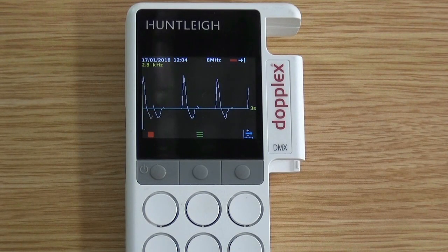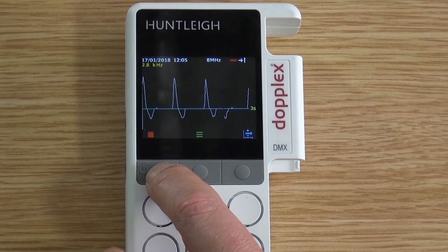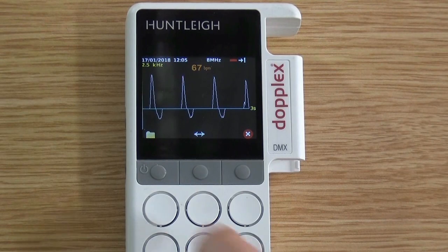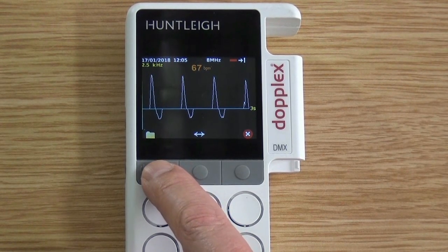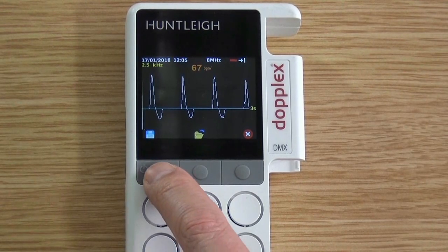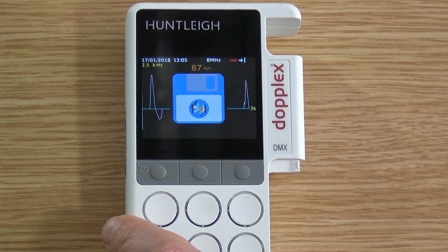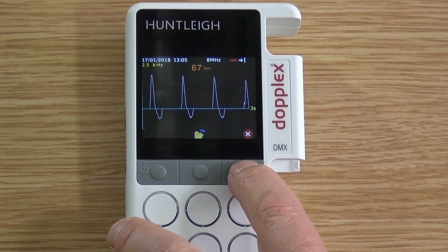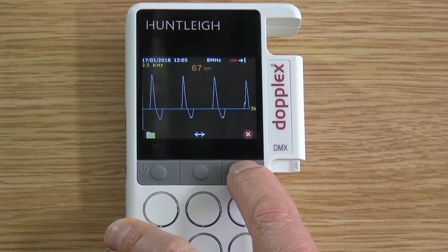Once a waveform has been found, press the stop button. If you are happy with this waveform, press the left button twice as shown — this saves the waveform to the memory card. To run real-time again, press the red cross twice.